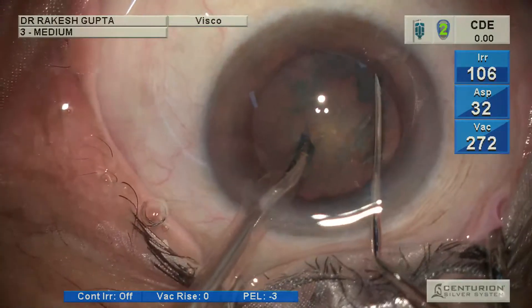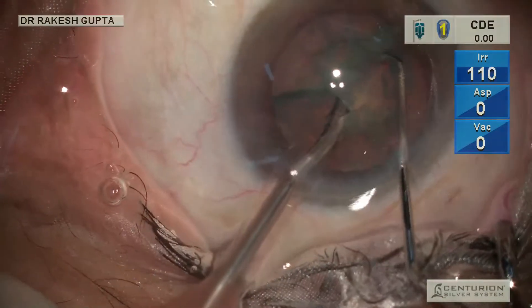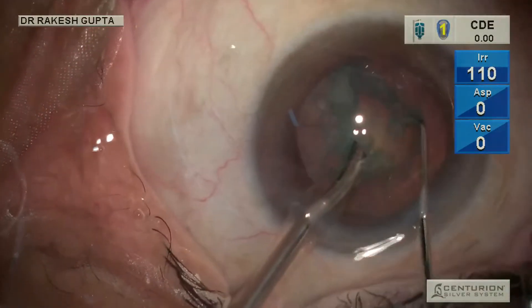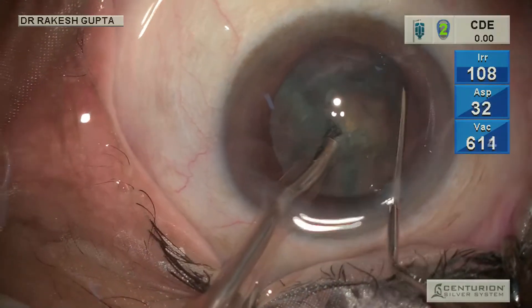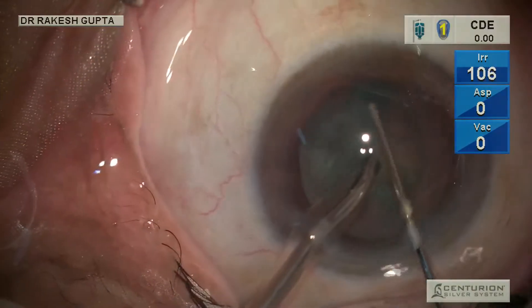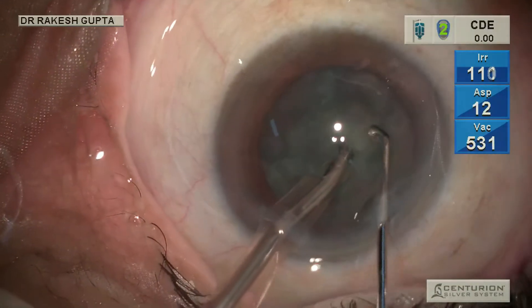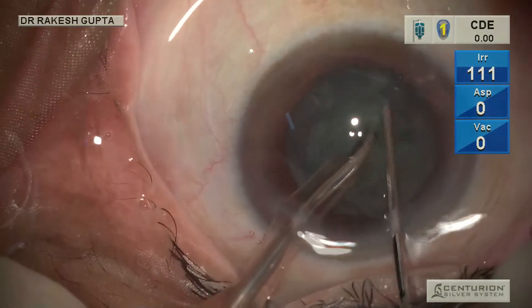Hello friends. Phacoemulsification has evolved drastically over the last few decades and there has been a tendency to minimize the use of phacoemulsification energy inside the chamber to reduce damage to the endothelium and related complications. We have evolved from four-quadrant to stop-and-chop, then direct chop, and now here is a technique where I am not using energy at all.